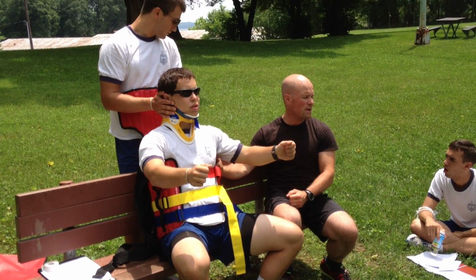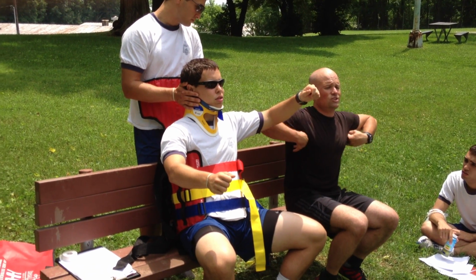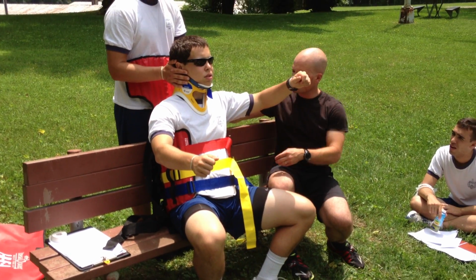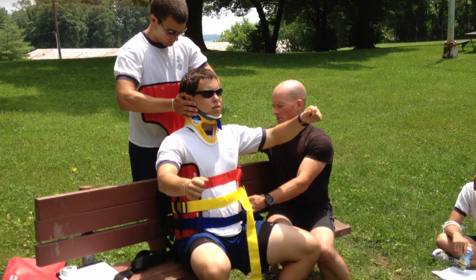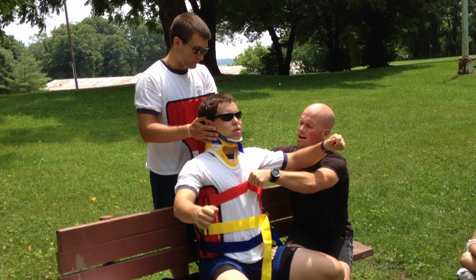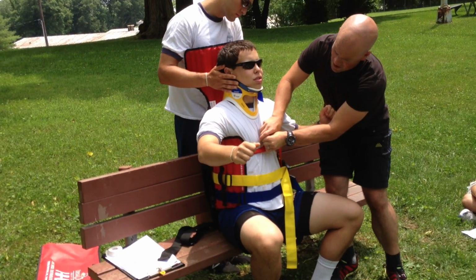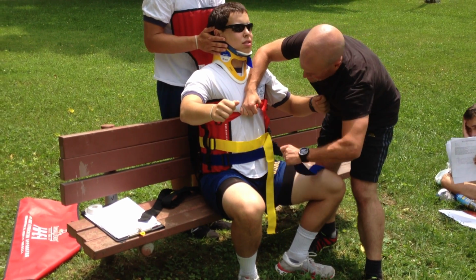And if I have a space between the top of the armpit and the device, this device is just going to go and slide up, and that's bad. I want to get all that sliding out of the way first. So I'm going to make sure that I've got these straps loose enough. Sit up a little bit for me, sir, so that I can slide this device nice and high into the armpits, and I can hold it there by just giving it a manly twist, like so. Manly twist. Yeah. And now that I'm holding that manly twist, I can start to really tighten this down.